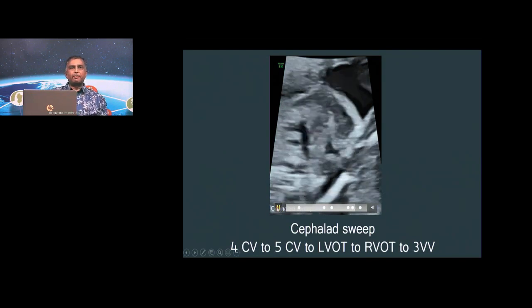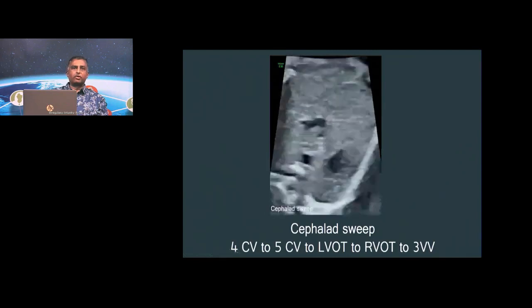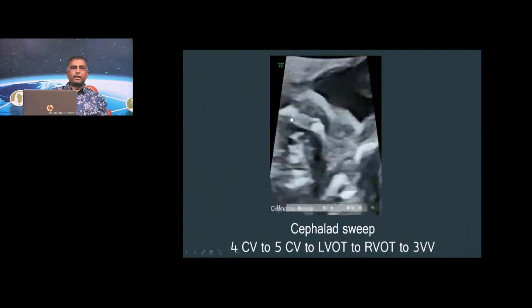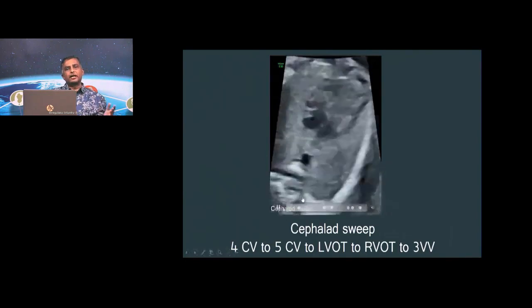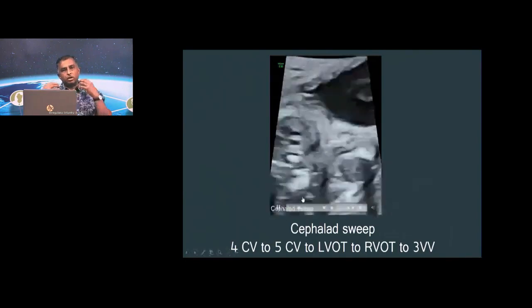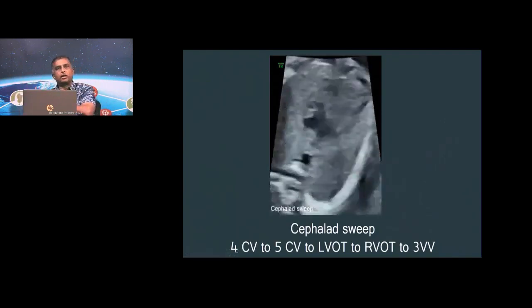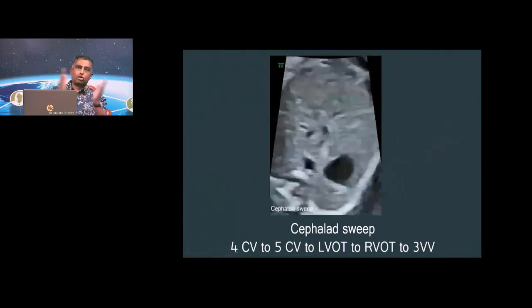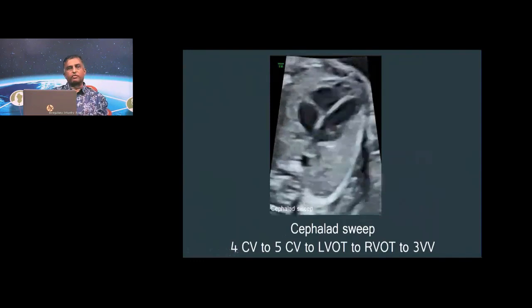for discussion. So when I play the clip, you will realize that all these unfold in front of you, and as you see, you find the aorta going this way, the pulmonary artery going this way, again telling you that there's a crossover. So store a clip, just like you store all those individual planes. I think you should store a clip as well, which will give you the perspective of the crossover very, very well.